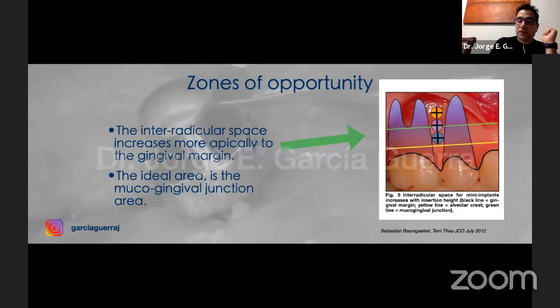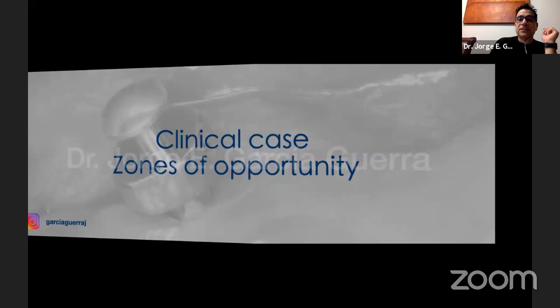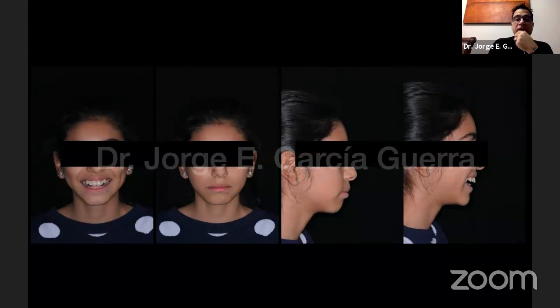Now I'm going to show you a case. We're going to start with the cases. This is a very young patient, around 13 years old. She's a very skinny patient. She has big teeth, so when she smiles, she has a lot of protrusion.